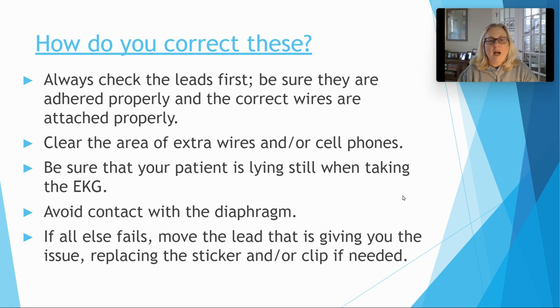Okay, move them, and then you may have to replace the sticker sometimes if the sticker for whatever reason is just not working. Like say V3 just keeps acting wonky. You've placed it on there flat, you've readjusted it, you've done all kinds of things. Just get a brand new sticker and try a new sticker. Sometimes that sticker is just faulty.